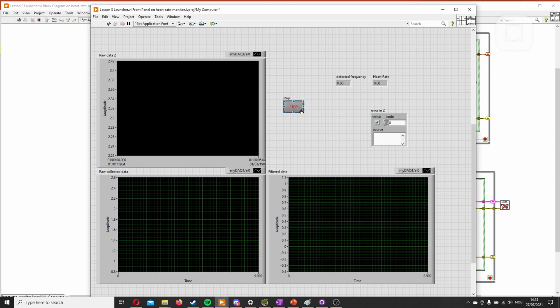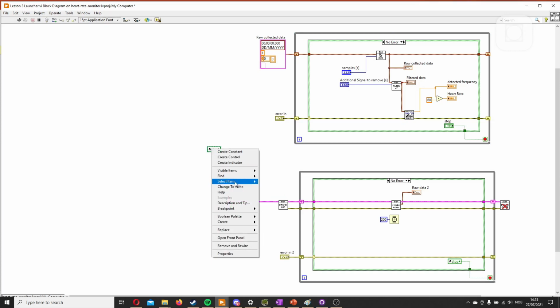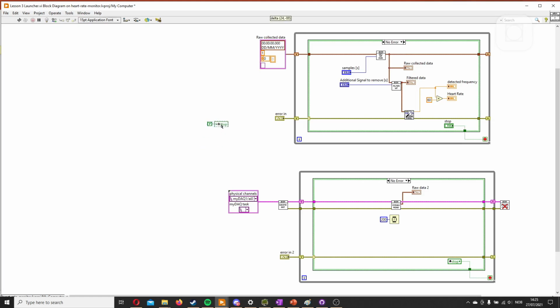The problem with this is after you press it when it's running, it won't pop out again until you press it out again. So the next time you run it, it will just stop immediately. To counter this, we'll just make a simple thing here, change to write, and then set it as false. And to ensure that this is done before all the other one, we can use the error loop to control the sequence of events. So we have this one error, it goes in both of them. It's just an empty control. And we have it here.